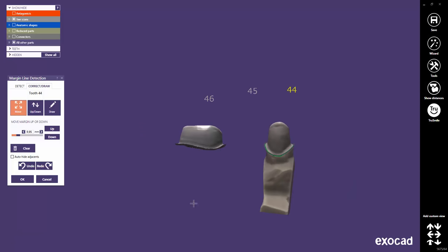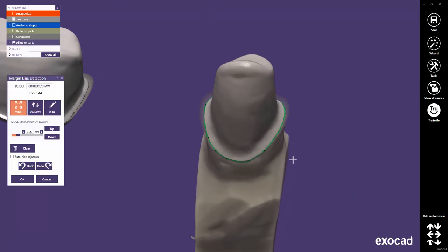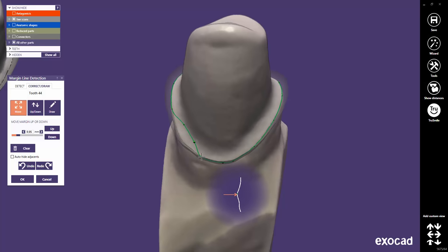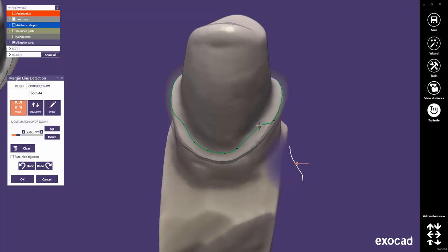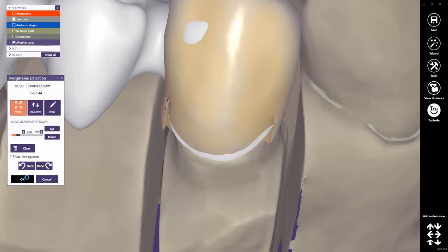The margin line detection window automatically starts with the correct draw mode. Now you can adjust the margin line. Click OK when you are done. Your design will not be lost when the new margin line is computed.